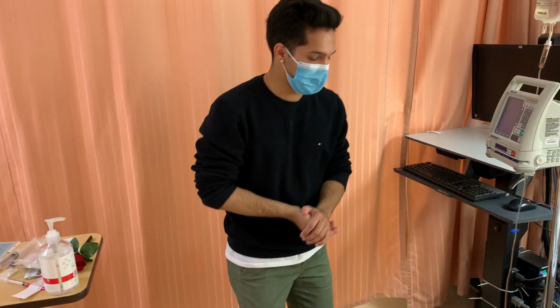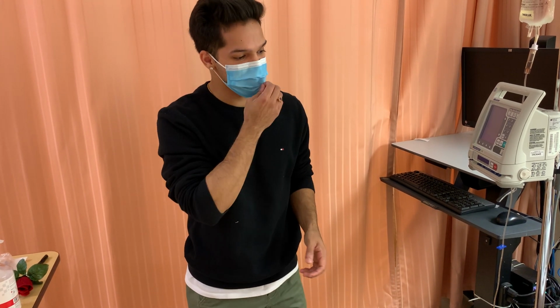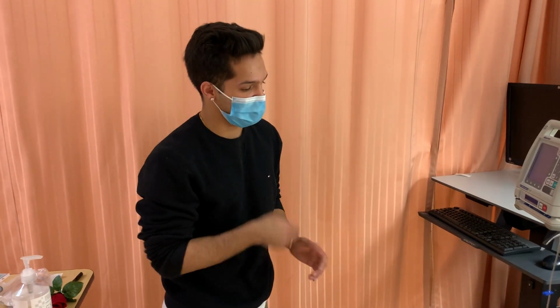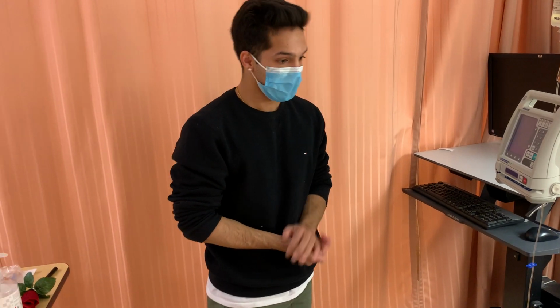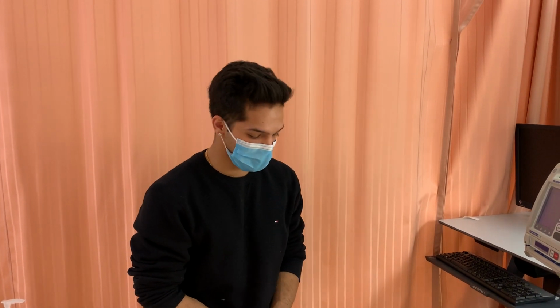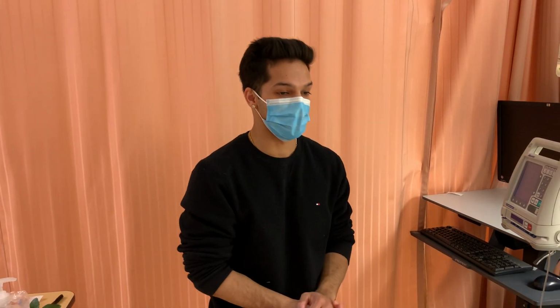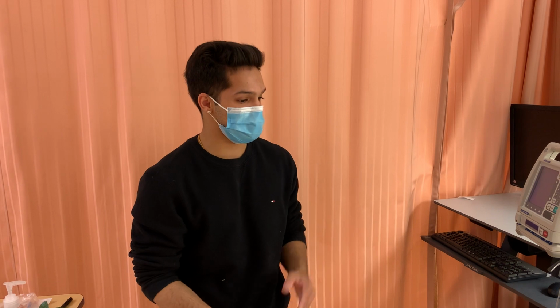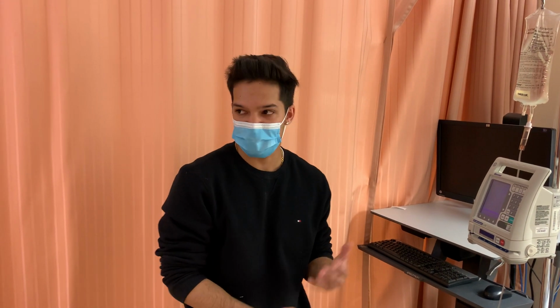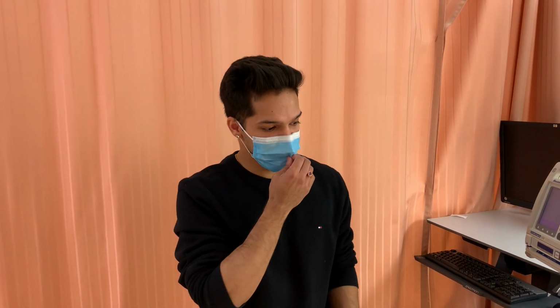Okay, Mr. Scotland, I am just going to be setting up your continuous insulin infusion. This is just for the high blood glucose you've been having lately. Our target blood glucose level for you is within 6 to 10 millimoles per liter, and you've been way above that, so this is an intervention to keep your blood glucose in control. Some side effects you might experience are signs of hypoglycemia, such as palpitations, sweatiness, and tremors. If you experience any of those, please use your call bell and call me, and I'll be here as soon as possible to assess you. Are you still fine with me giving you this medication? The patient has given me consent.